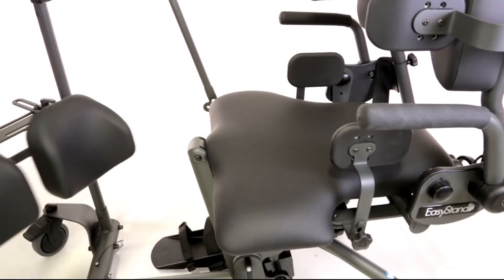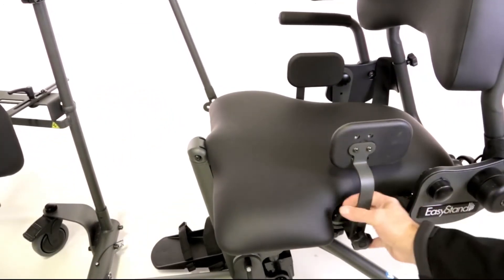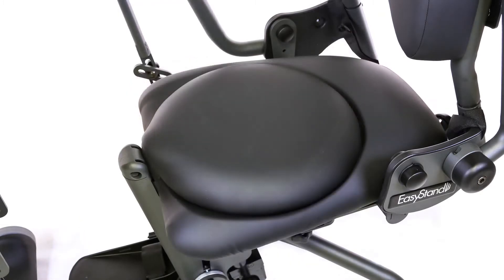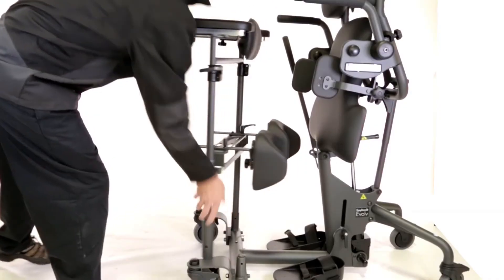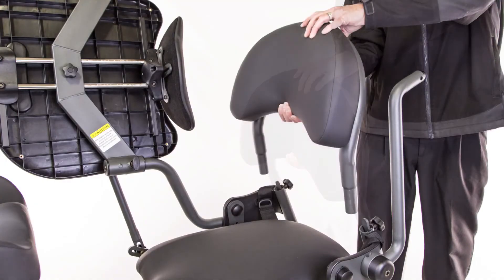The Evolve's open base makes independent transfers easier. A larger transfer seat or rotating seat can be added to make transfers more manageable. To make standing pivot or lift assist transfers easier, an optional swing-away front or removable back can be added.